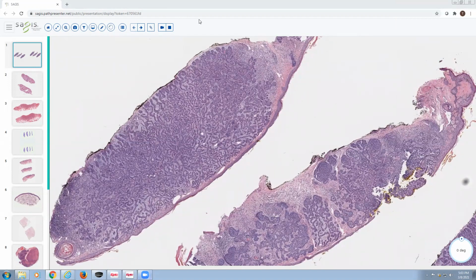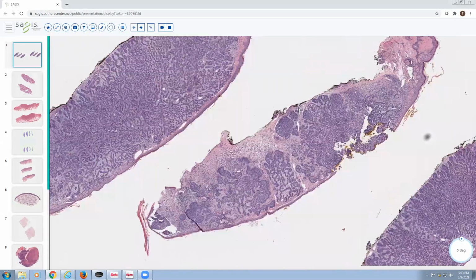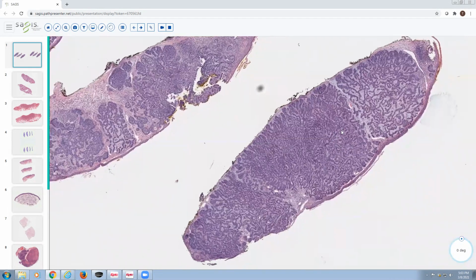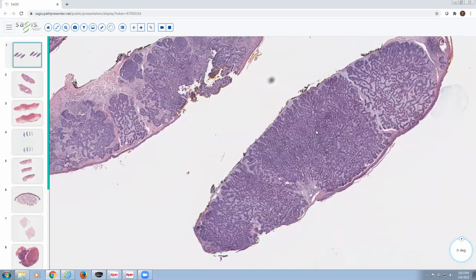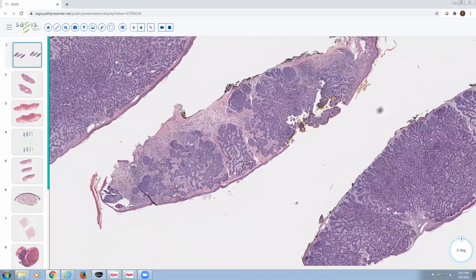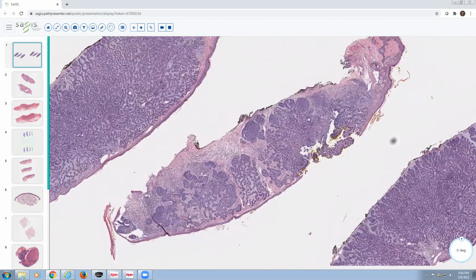Okay, so our first diagnosis that we're going to review is a variant of basal cell carcinoma. Basal cell carcinoma is definitely a bread and butter diagnosis in dermatopathology, and hopefully one that you all are able to recognize from not only studying, but also just routine sign out. We're going to look today at an example that I would describe as micronodular. Basal cell carcinoma, as you know, is the most common type of cancer in humans, so something we see very commonly, not only in patients, but under the microscope.